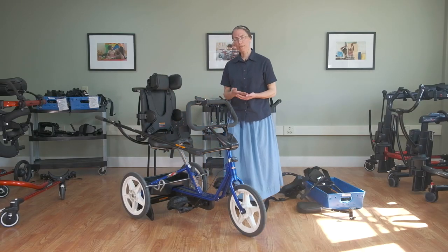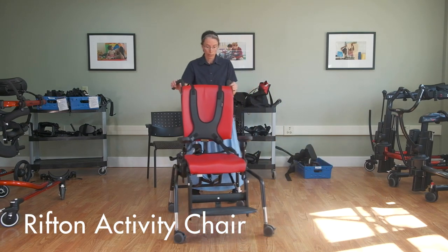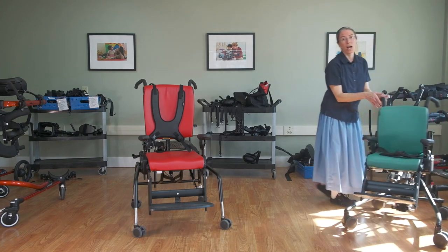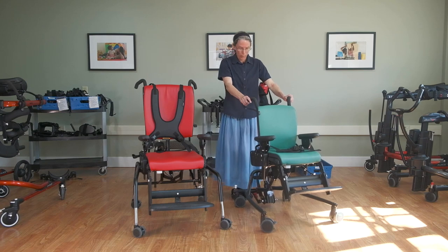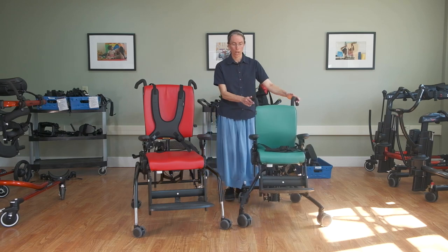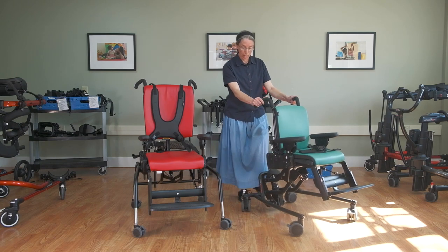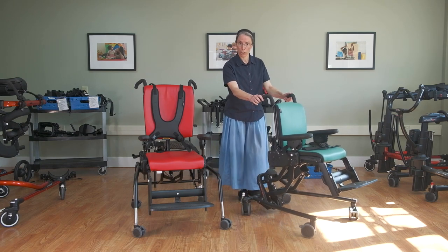The third headrest is just flat. Here we have the large standard base and the medium high-low. Anything I show about the chair adjustments or components and accessories are available for all sizes and either base style.